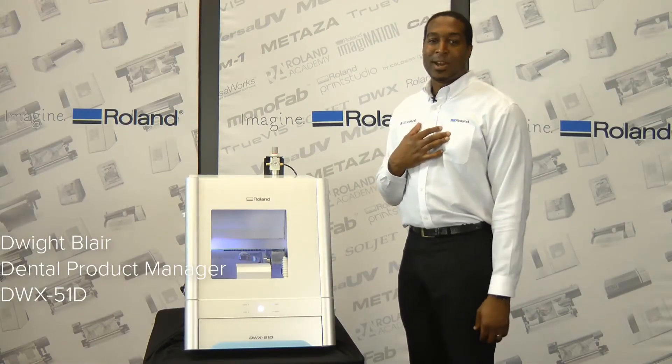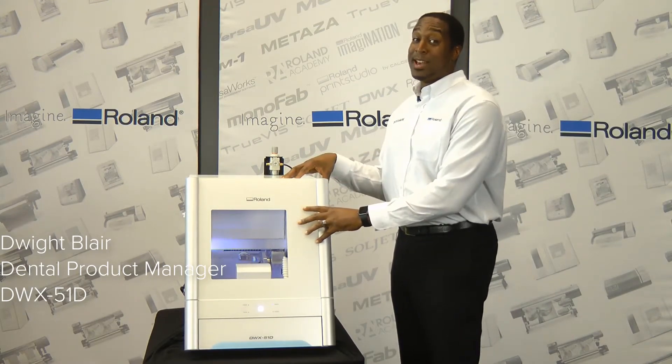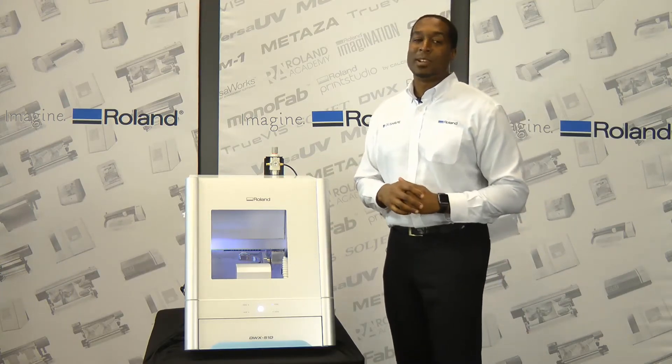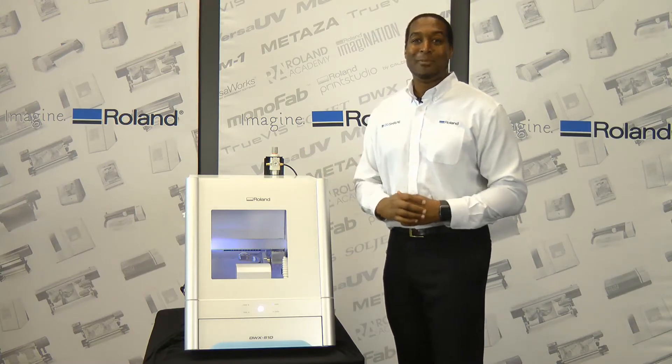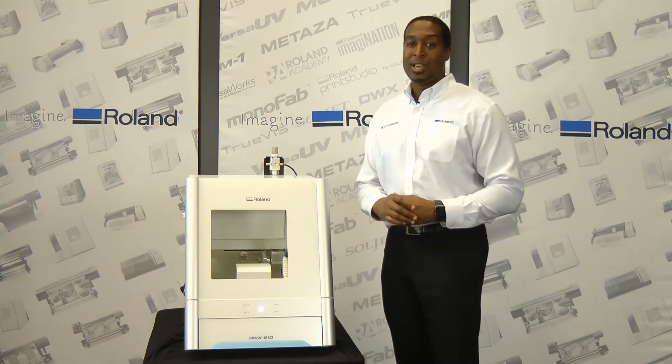I'm Dwight Blair, Dental Product Manager at DG Shape by Roland, and this is the DWX51D Dental Dry Mill. If you're a user that has experience with the DWX50, the DWX51D employs the same 5-axis milling capabilities that you're used to, which are key for long-span bridges, models, and denture bases.